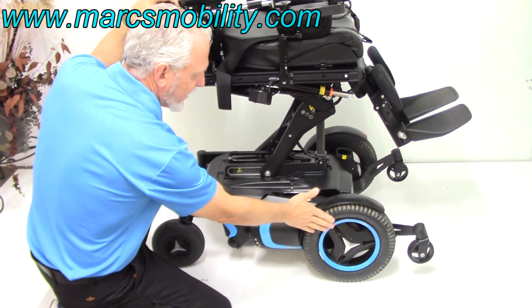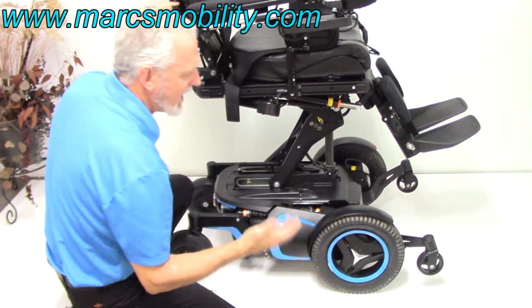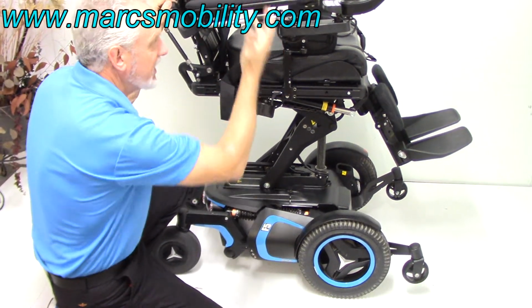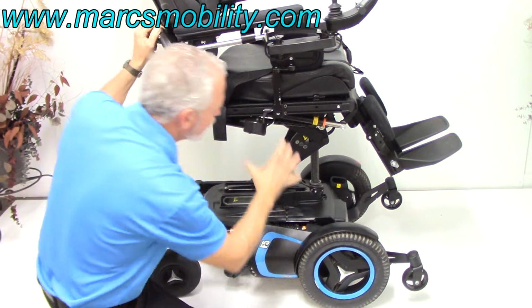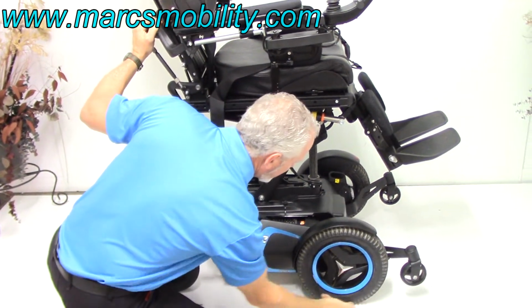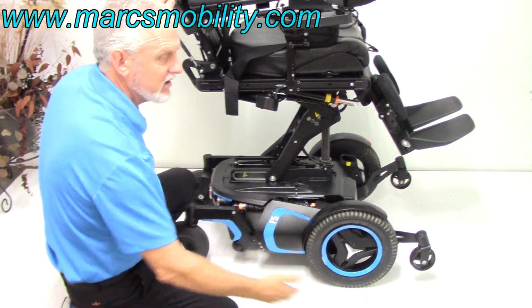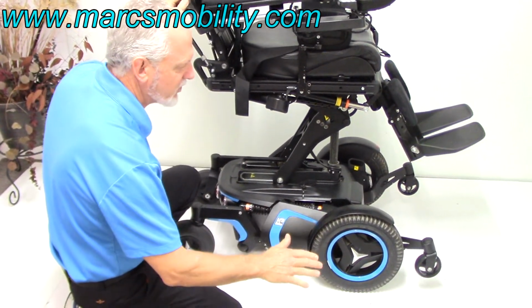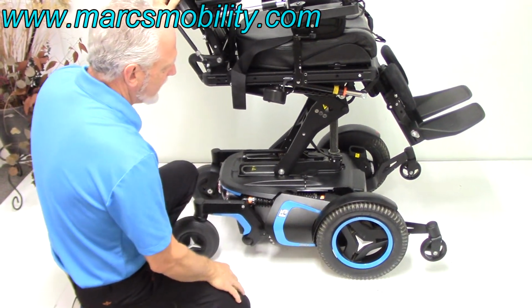This is a front wheel drive chair, meaning your motors and your wheels are in the front, so when you're outside, if you've got a 200-pound person sitting in this chair, and the chair itself weighs 400 pounds, that's 600 pounds of weight transferred to this wheel all the way to the bottom here. There's nothing holding this wheel, so it's good for the grass. You're getting good traction because you've got a lot of weight down on the grass or wherever you're using it. That's a benefit of a front wheel drive chair.